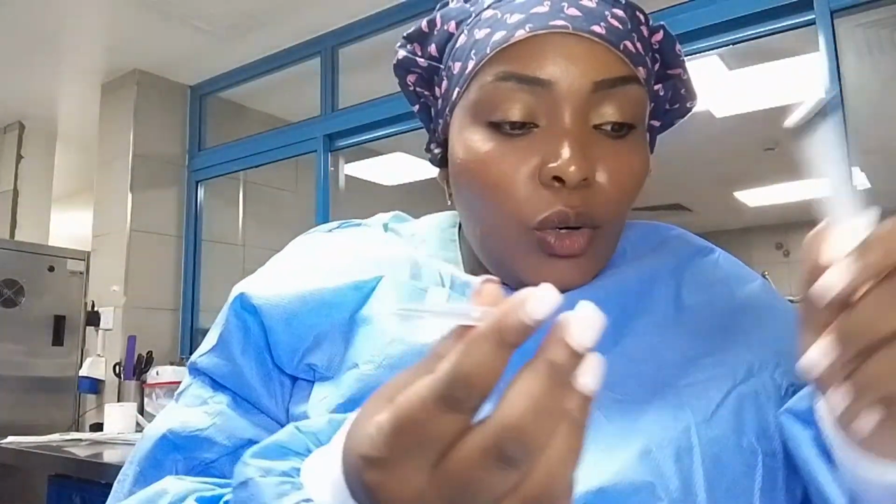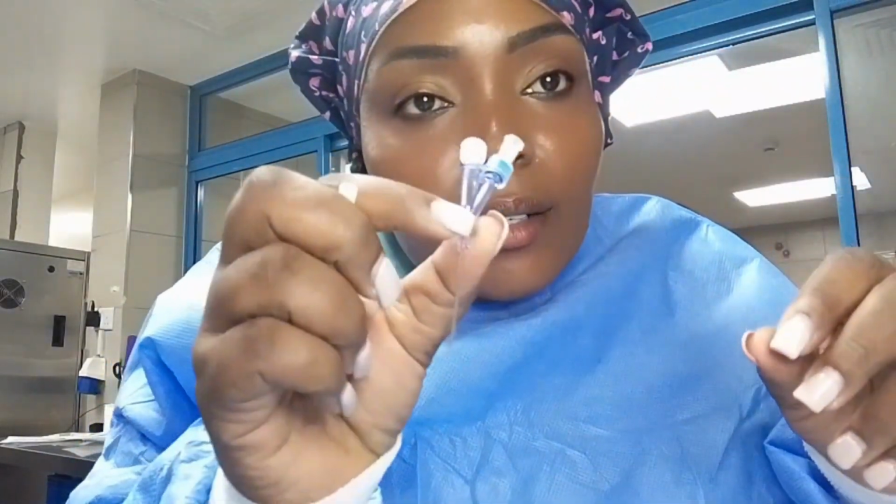This is a syringe with a needle. We call this the finder needle. Then you connect it to a normal needle and a syringe. I hope you can see how the finder needle looks.